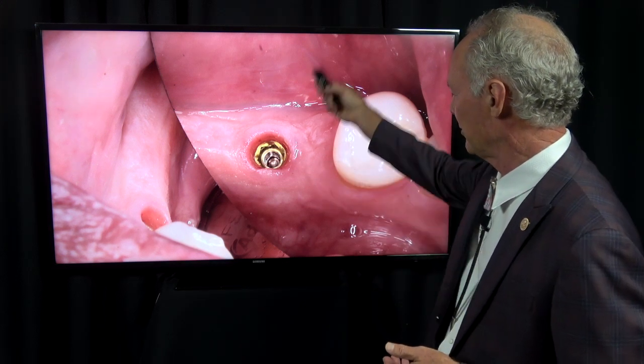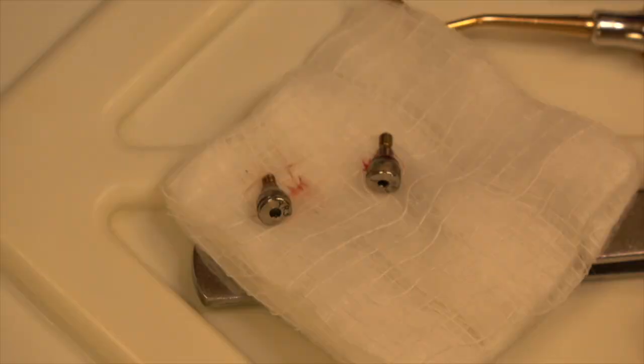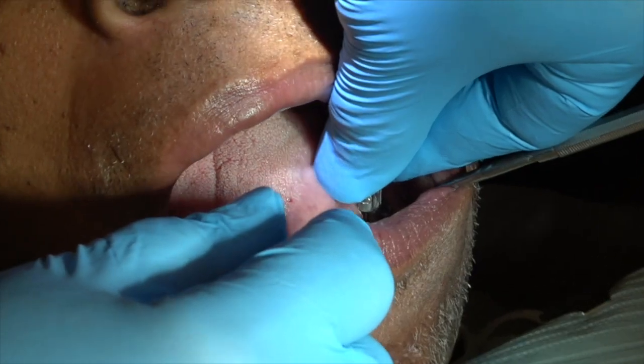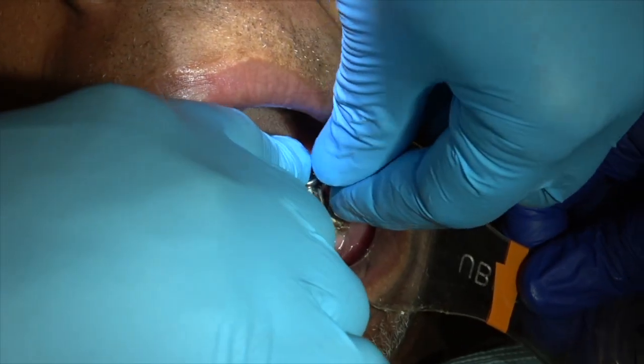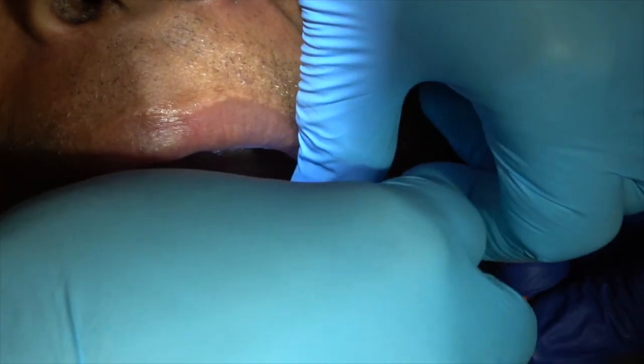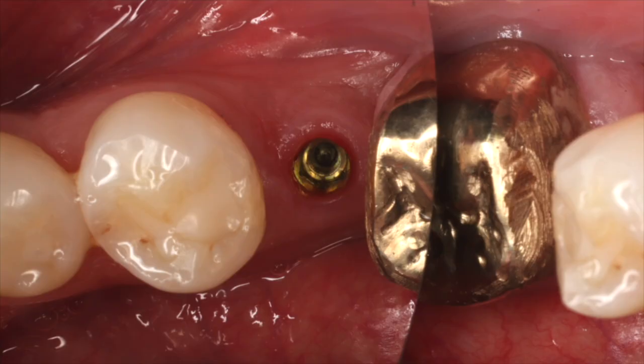You can see we've got nice emergence profiles with these long healing caps. When I place the implant through the soft tissue using the drills without reflecting flaps, these long healing caps create a great emergence profile. That's a tight squeeze on the bottom.